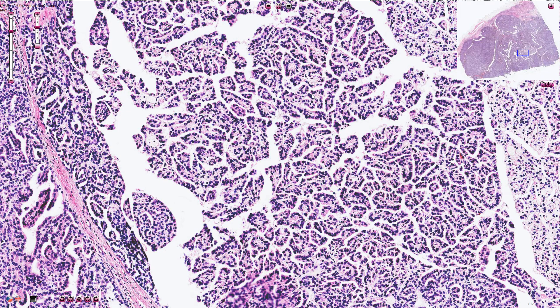Here we can see the papillary pattern of growth, where the tumor forms papillary structures lined by neoplastic cells with central fibrovascular cores.